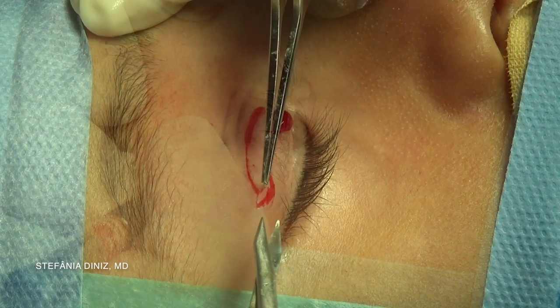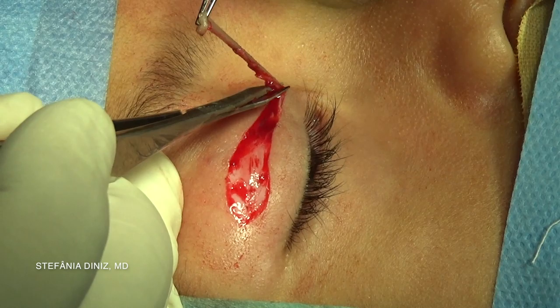A small blepharoplasty incision is made and Westcott scissors are used to excise a flap of skin and orbicularis.